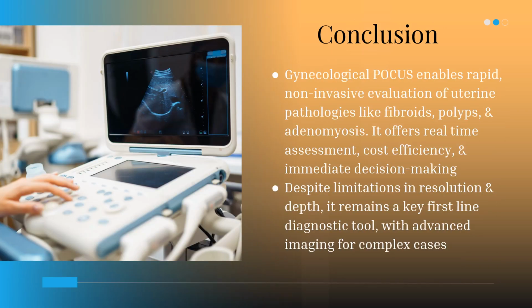So as an overall conclusion, I just want you guys to know gynecological point of care ultrasounds are just as important as obstetrical ultrasounds. A lot of people will come in with pelvic pain, discomforts, issues, and you can get a lot of information pretty quickly with a bedside ultrasound if you have the knowledge and skills to know what you're looking for. Then you can be the gateway to, okay, we need a formal ultrasound, we need to do an MRI, we need to just wait and watch, see if this grows, see if it's there in a week or two after doing XYZ recommendations.